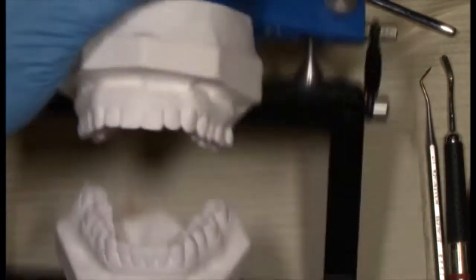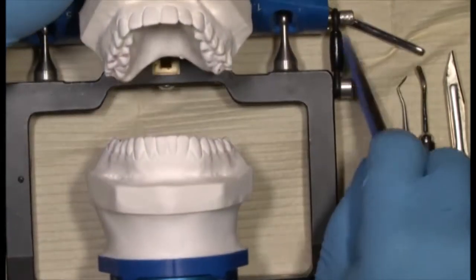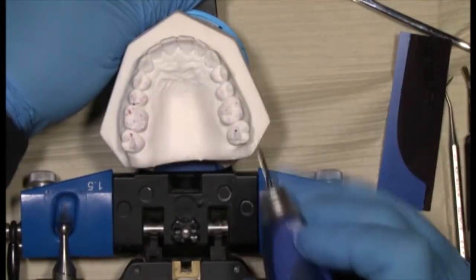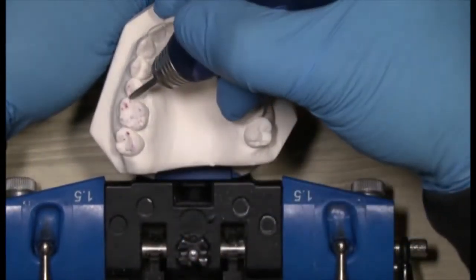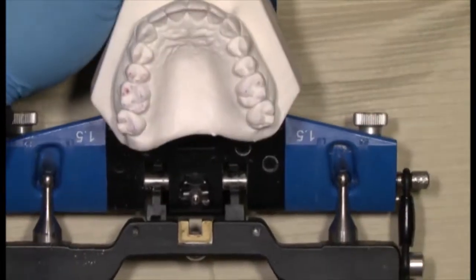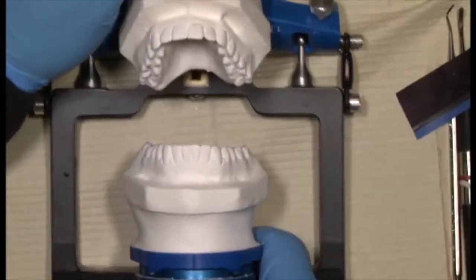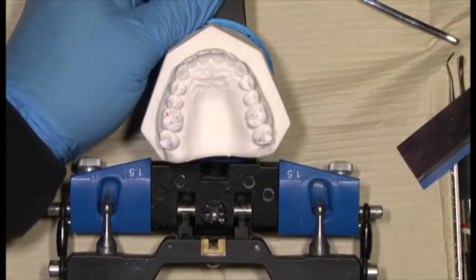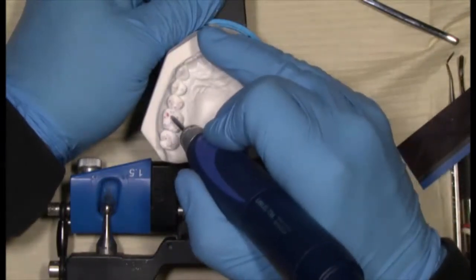So I'm going to switch these to blue, so we'll see what we're able to achieve. So we have contact almost to the second bicuspid, but we have one starting to happen on this left side. And notice it was just here. And you would keep doing this until you get as many contacts in the posterior without any in the anterior, or at least until the cuspids couple. If it's on a cusp tip, don't touch it.